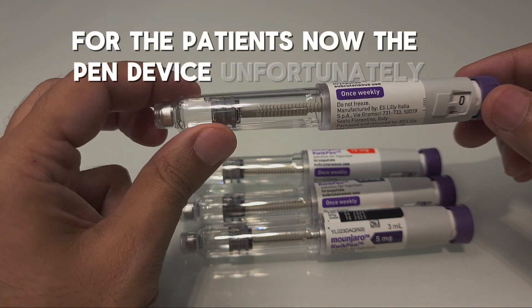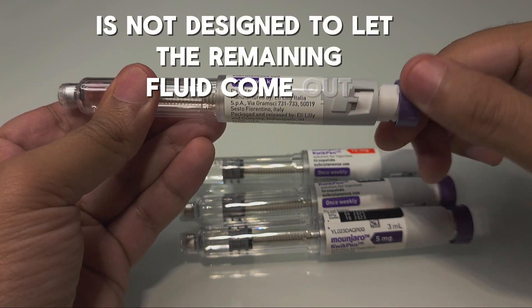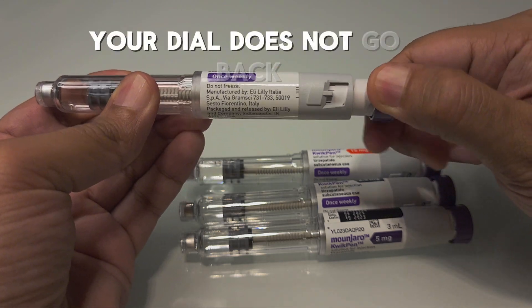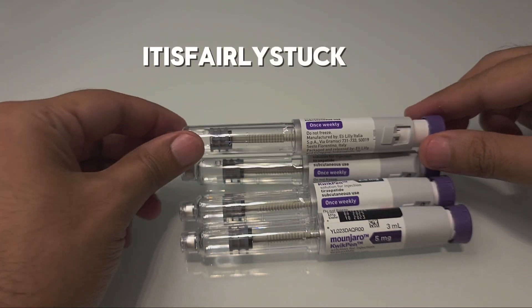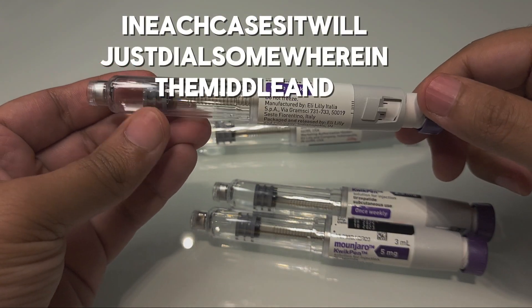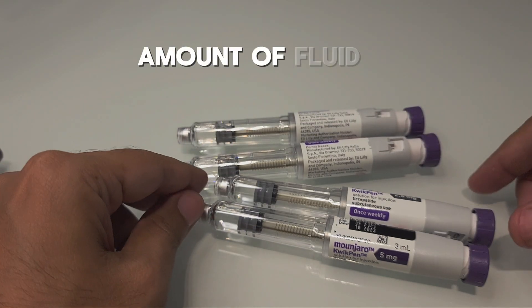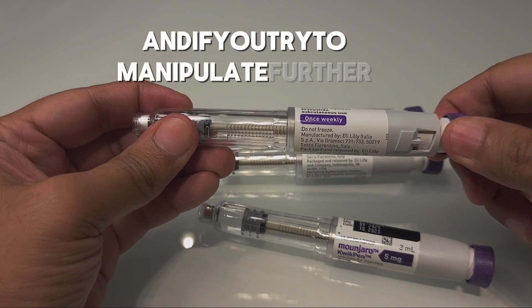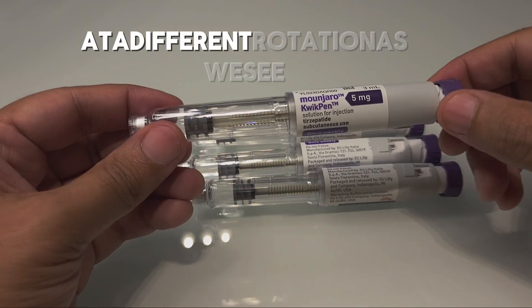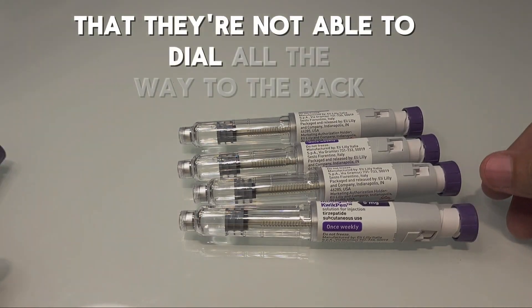Unfortunately, the pen device is not designed to let the remaining fluid come out. If you try to dial further, the dial does not go back — it is fairly stuck. In each case, it will dial somewhere in the middle and will not dial further to give you the remaining fluid. If you try to manipulate further, each pen device dials at a different rotation and they are not able to dial all the way to the back.